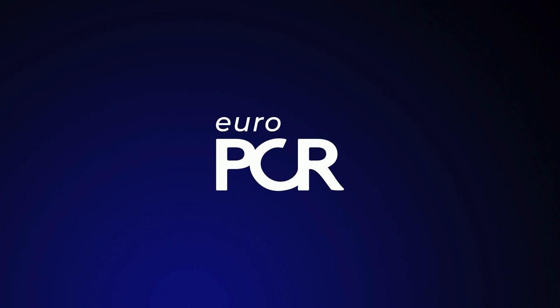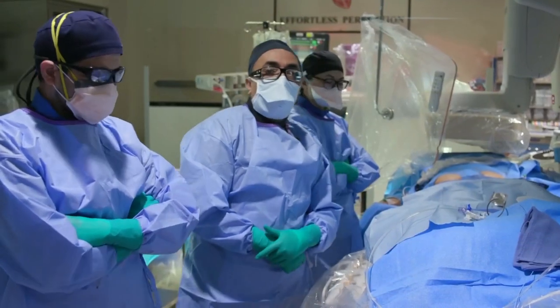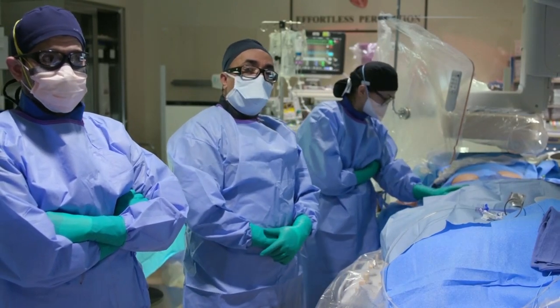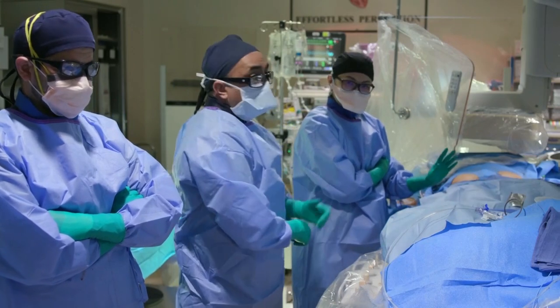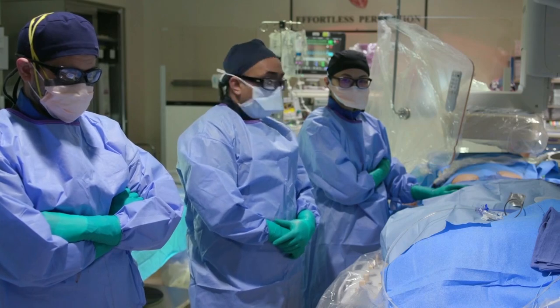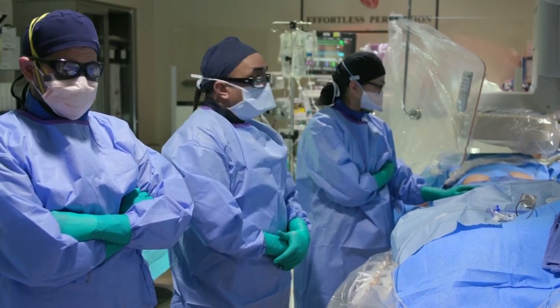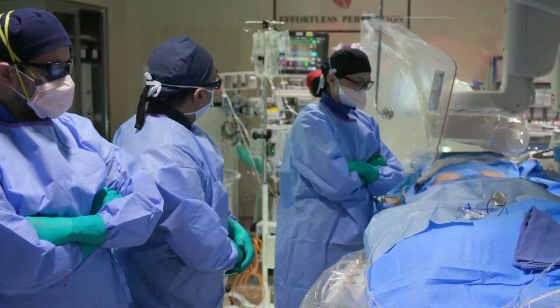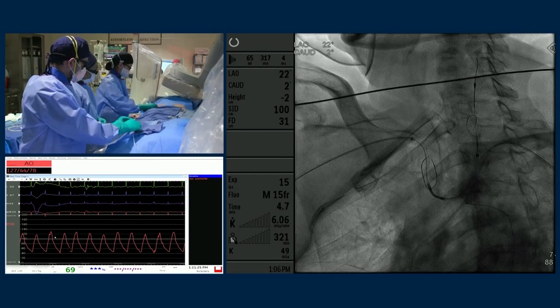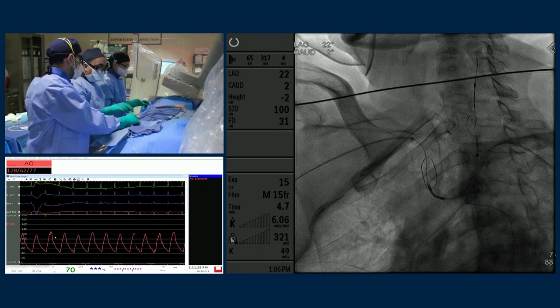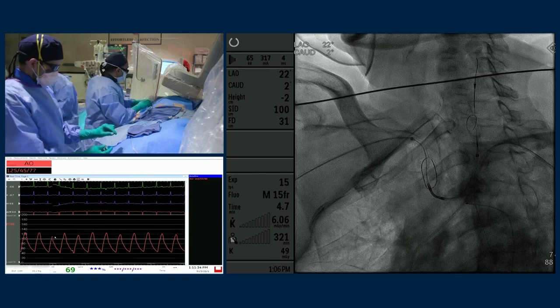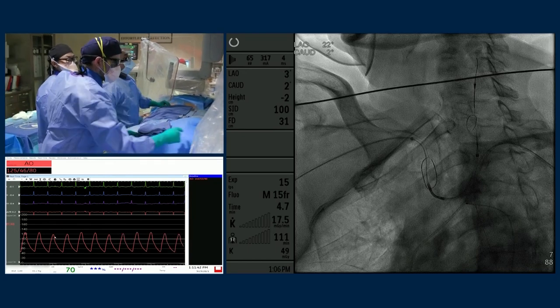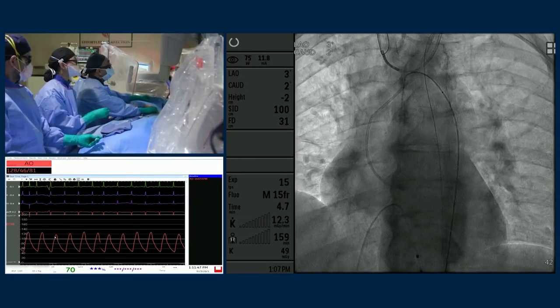Welcome to Montefiore Medical Center. The team includes Azeem Latib, surgical partner Mei Chao as first operator, tech Jesus Montezina, and support staff Stephanie, Shireen, Angelisa, and anesthesiologist Liz. We have protection in place and need to do a left heart cath — the patient's coronaries looked fine on CT scan with no significant calcium, but we need to document absence of coronary disease.